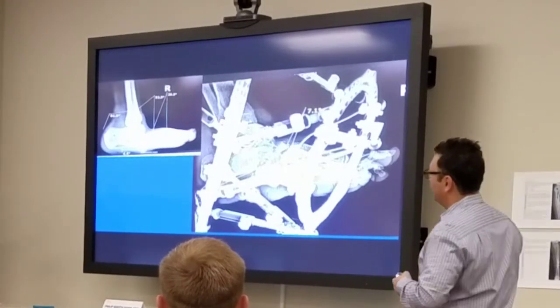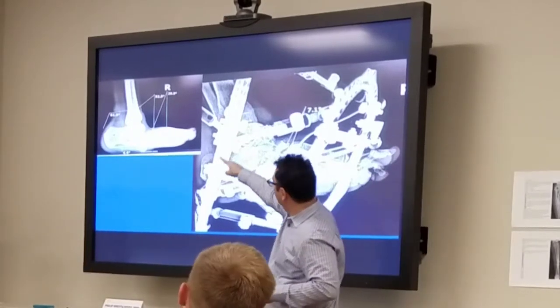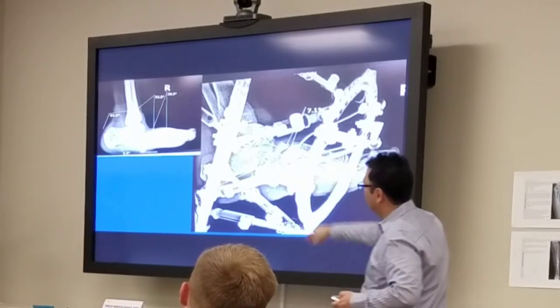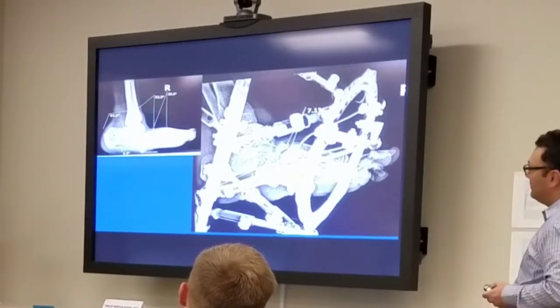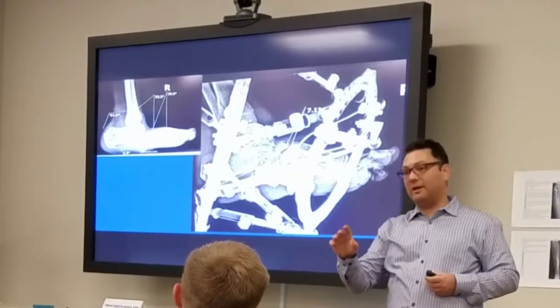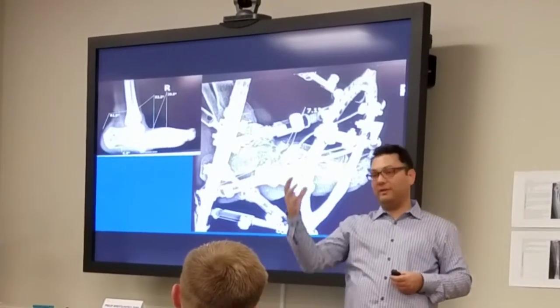And now here we have, that's your beginning, and there's your end, so you got that nice alignment over there, get myself a nice calcaneal inclination. But you did not do a rear foot osteotomy, you're just dragging it. No, that's what I'm saying. I just nicked the Achilles and just pull that thing down.